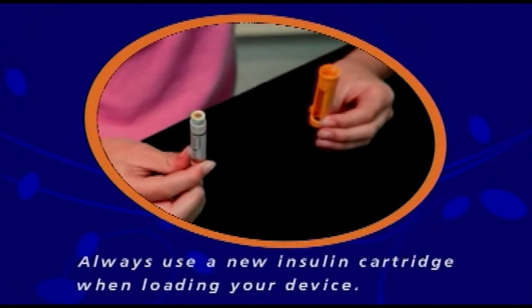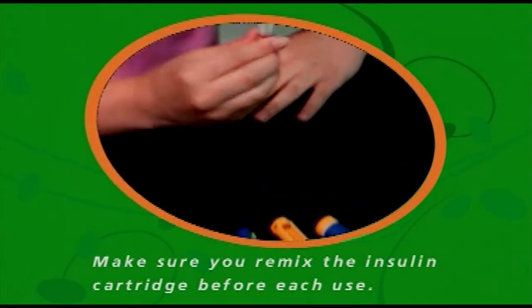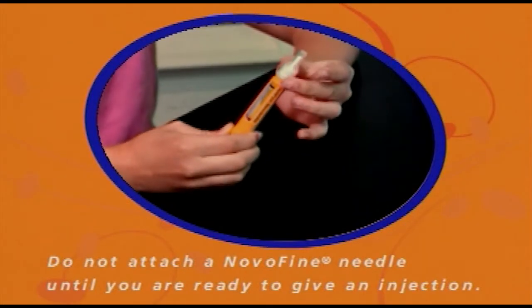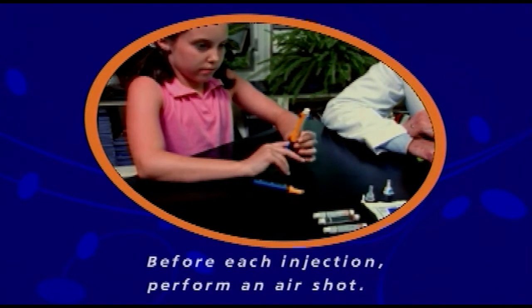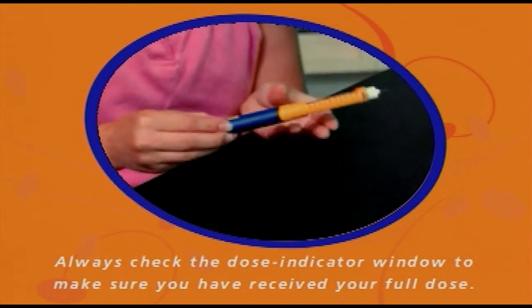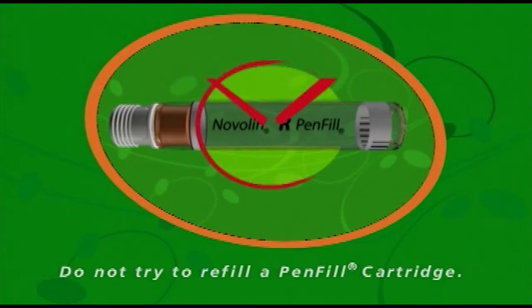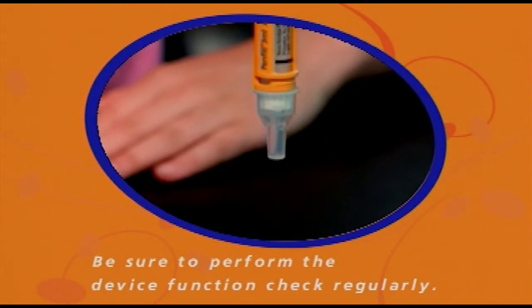Always use a new Novolin pen-fill cartridge when loading your NovoPen Jr. Never load NovoPen Jr. with a partially filled cartridge. If you're using Novolin N or Novolin 70-30 insulin, make sure the cartridge has enough insulin for mixing and remix before each use. Do not attach a Novofine needle until you're ready to give an injection. Before each injection, perform the air shot with the Novofine needle pointed upward. Select your dose only by using the number in the dose indicator window — do not use the clicking sound to set your insulin dose. Check the dose indicator window after each dose to make sure you've received your full dose; a zero should appear in the window if you've done this correctly. Carefully remove the NovoFine needle immediately after each injection. Make sure the cap is not on. Do not try to refill a pen-fill cartridge.